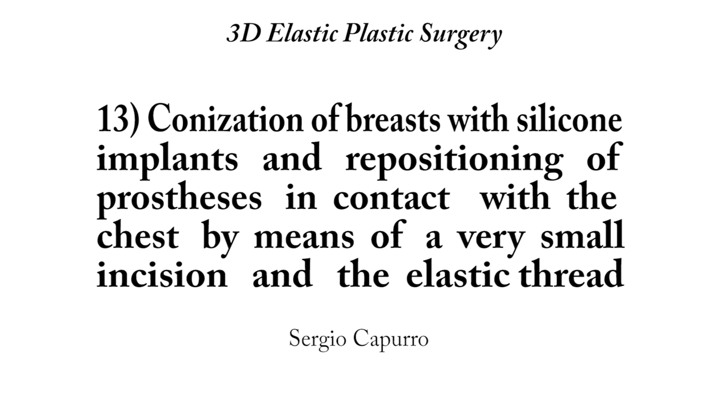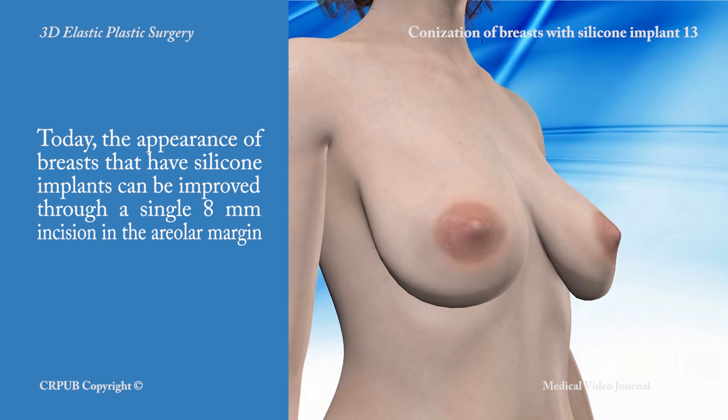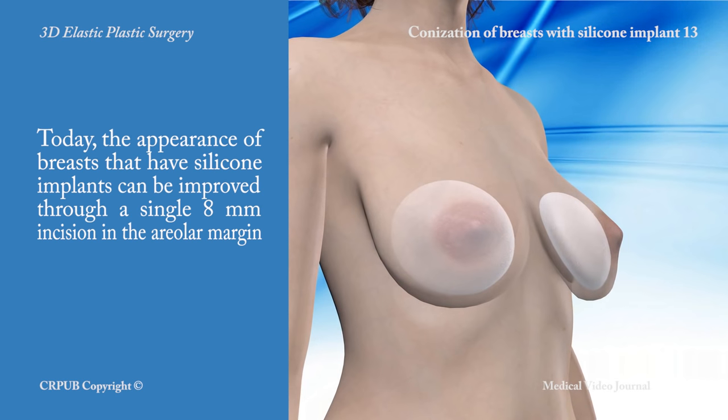Conization of breasts with silicone implants and repositioning of prostheses in contact with the chest by means of a very small incision and the elastic thread. Today the appearance of breasts that have silicone implants can be improved through a single 8 mm incision in the areola margin.